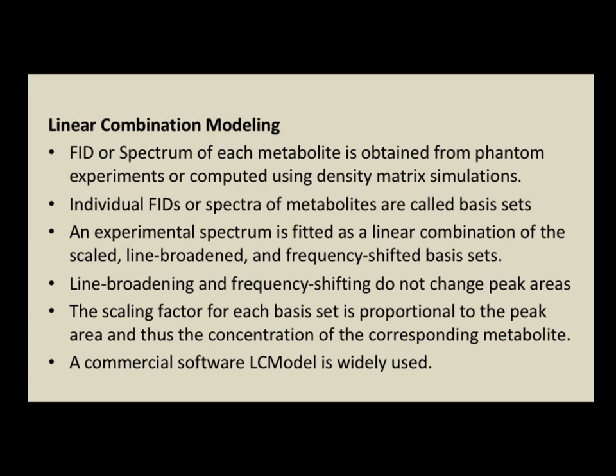Then the real data from a subject can be fitted by linearly combining the basis spectra. We call it basis sets.